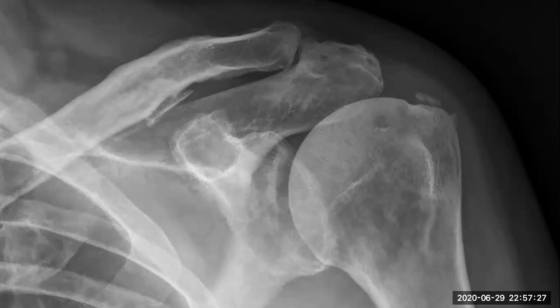We showed acromioclavicular separation grade 3, remember it. And the space between the coracoid and the clavicle, the coracoclavicular ligament, how much is the space normally? About 11 to 13 millimeters. Yes, 13 millimeters. Here the space is narrowed, with calcification.